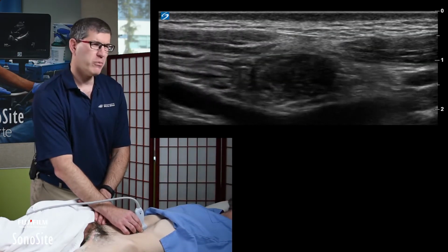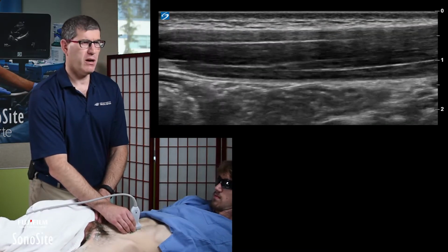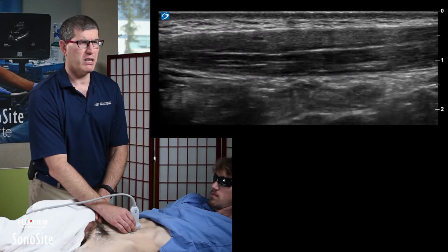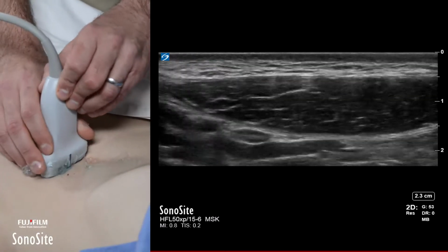And go upward, bring your shoulders off the table a little bit. Okay, and go back down, and let's do that again. Have you bring yourself up. I can see that muscle contracting and go back down. I'm now going to rotate the probe.